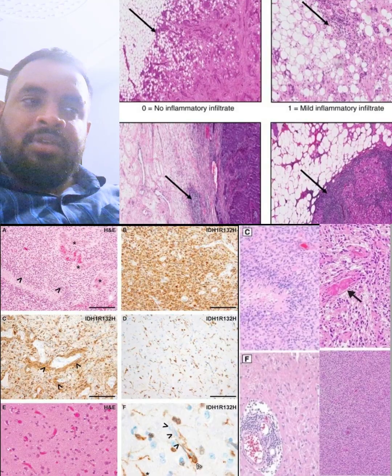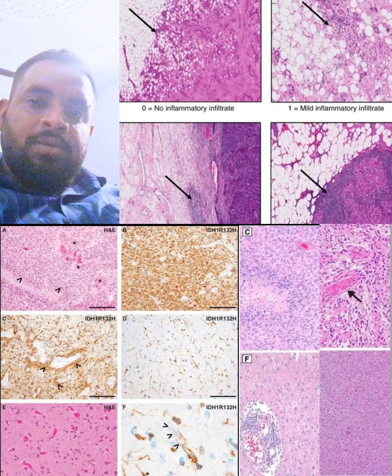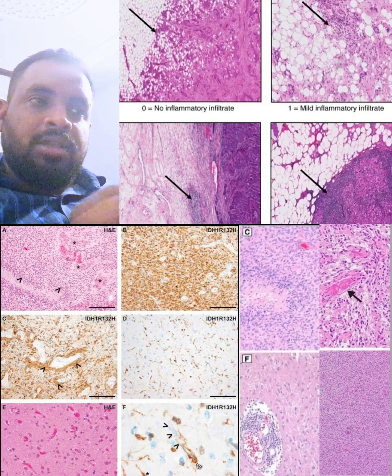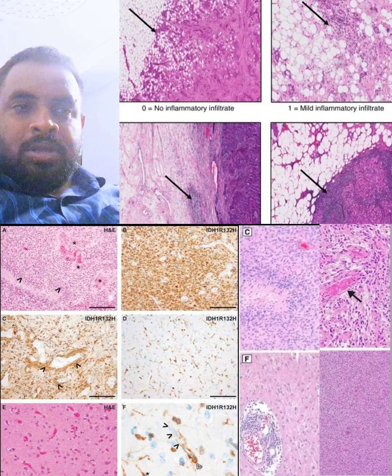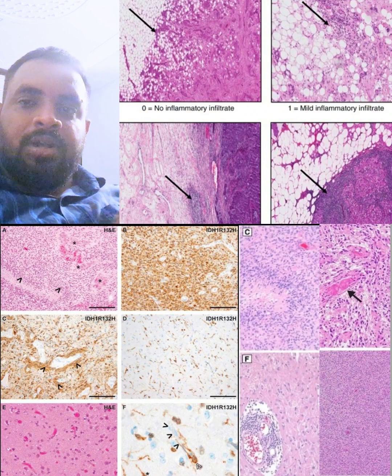Ultimately the body and its cellular compartment were successfully able to stabilize themselves and recover, and where the inflammation happened, the residual matter temporarily makes a residence there. Those typical lesions, if you see them, are of an infiltrative nature.